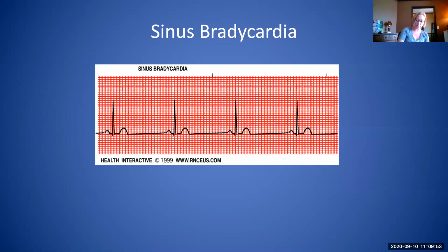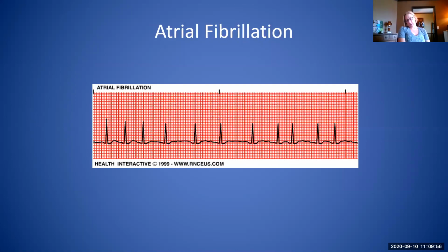All right, so here we have AFib, atrial fibrillation. It really looks like the name implies. The atria is our P wave, right? Our P wave will be affected if it's an atrial problem. Do you see any normal P waves here? There are no normal P waves. So it's an atrial problem because you can't identify any specific P wave. What that atria is doing is fibrillating. It's just quivering. That atria is not pumping the way it would in a normal sinus rhythm.